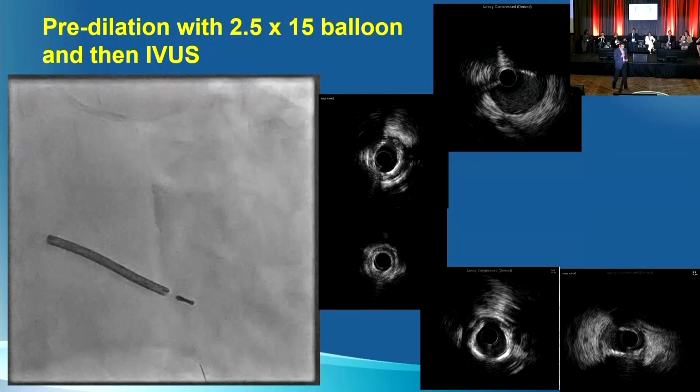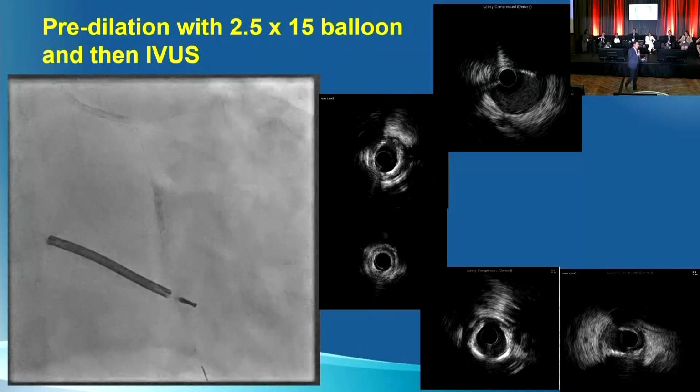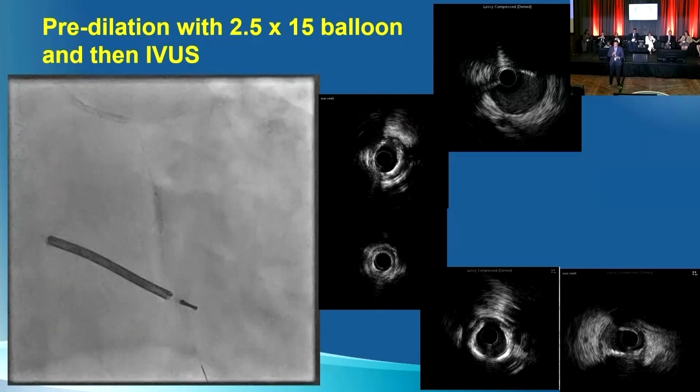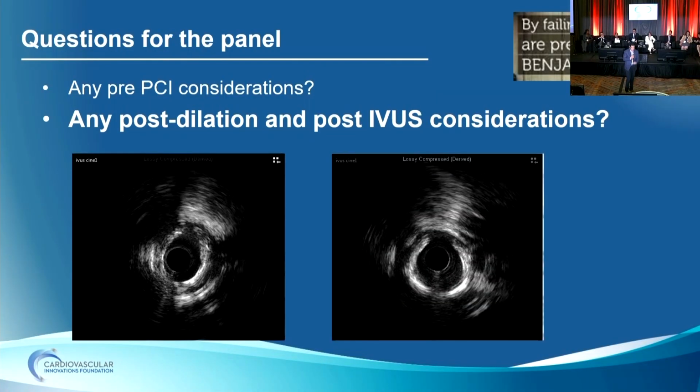Yeah, and that's what my impression was. Gosh, the wire wired very easily. Sometimes you get feedback from the wiring. If it's kicking your guide out, you have a very recalcitrant area. The wire wired easy, the balloon looked like it inflated. I thought, gosh, this looked okay. And I look at the IVUS, but it didn't make me think I needed to now put a rota in there and start burring this thing.